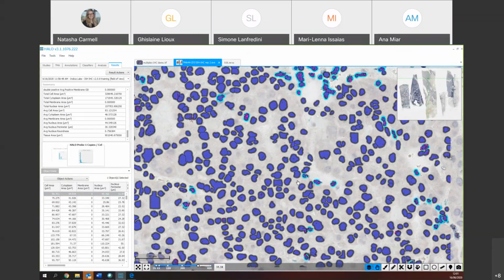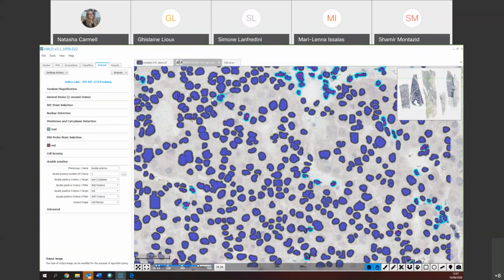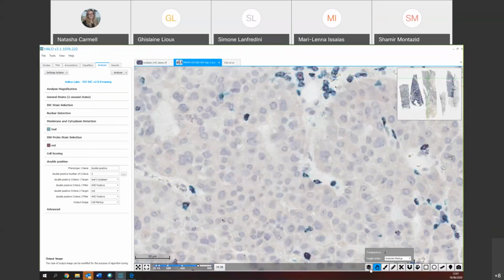Thank you. Yeah, my question is, when there is a lot of expression in the cell, we often see that the dots get merged into each other. So is the size setting the way to segment the merged dots? Yes, so exactly, actually a smart idea of yours.